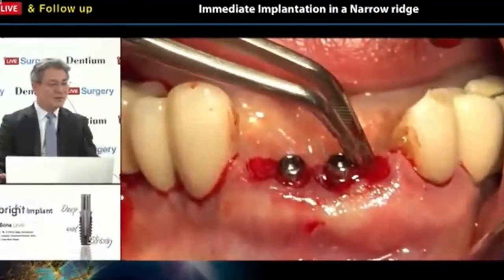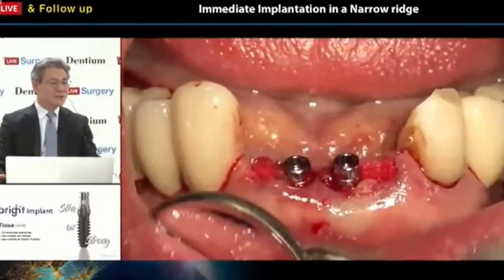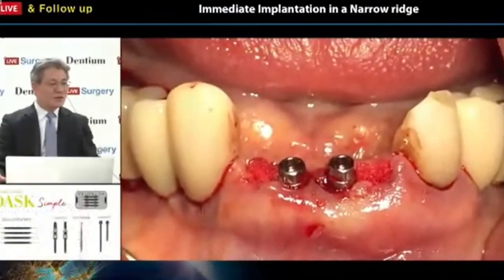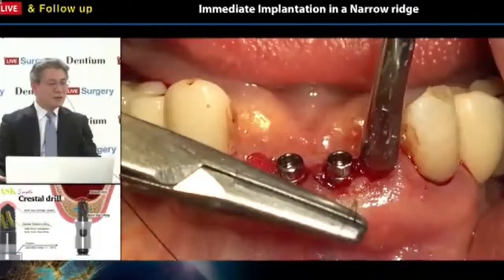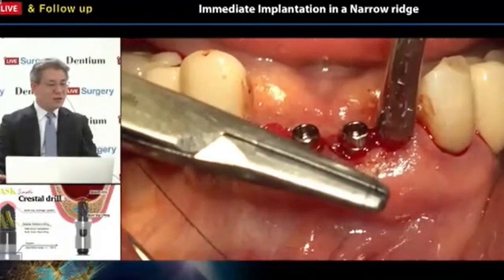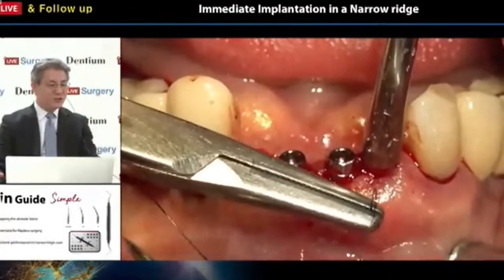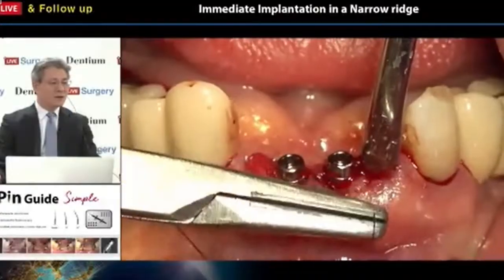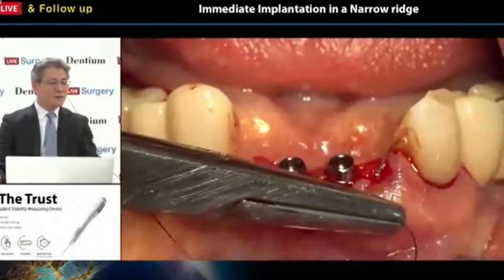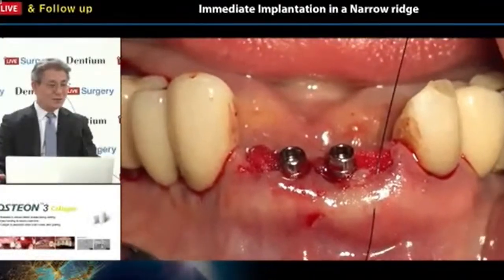Sometimes it has a little bit of barrier function. However, the main function is to make wound healing faster through the epithelialization of the epithelial cell layer. Okay, right, very nice, a very clever method.